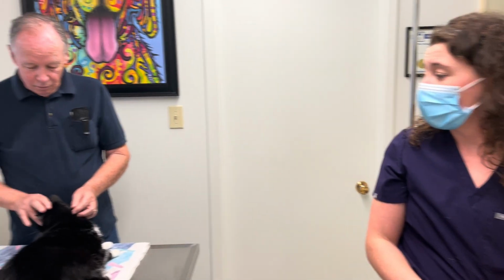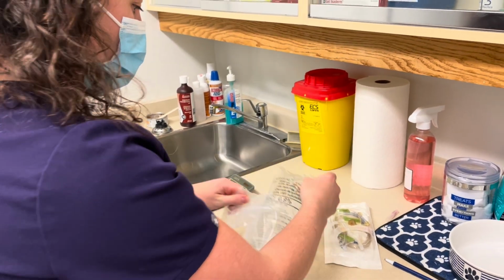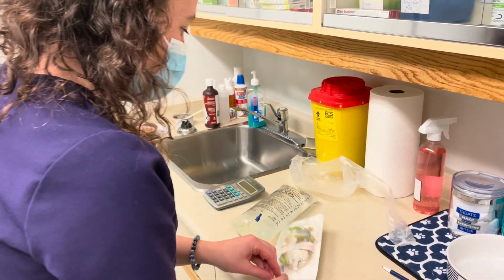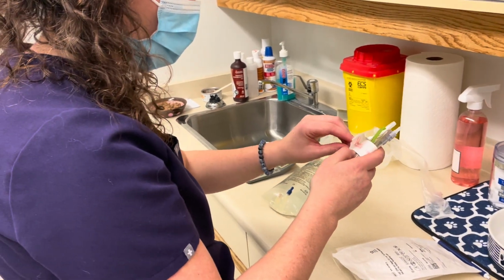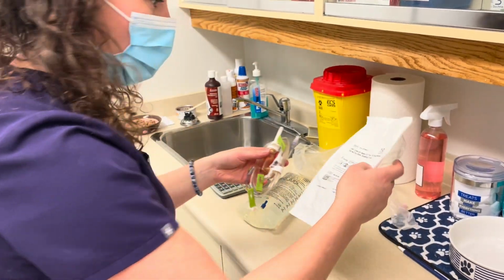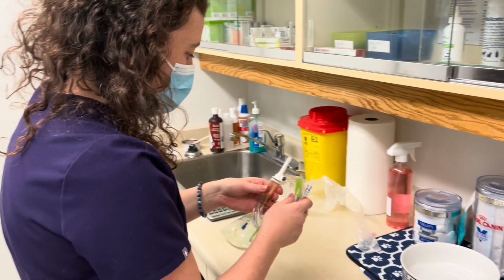So we're going to be giving him some fluids, and I'm here with my clinical mentor, Dr. White. So we need to aseptically prepare. Okay, so in order to start, we're just going to remove the bag like this. Open this up here. So you can see here it says 10 drops per mil macro drip. Okay, so we know how many drops is in a mil.